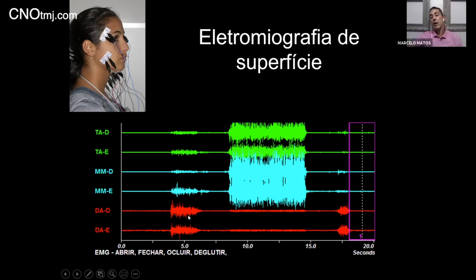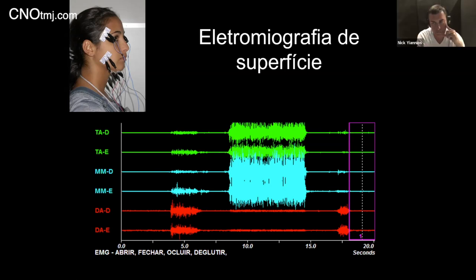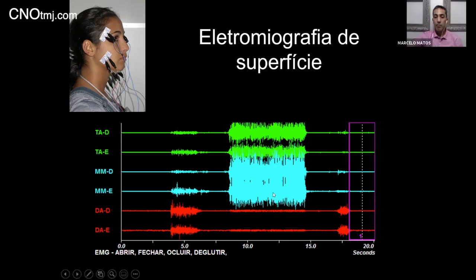But this is not enough. This is not all we can do with the EMG. Let's say this person fires around 80 microvolts. Is it good or bad? Depends. If the person is capable of firing 300 and is only firing 80, it means that most of the muscle is not working during its job. What is the job of a masseter? Close the mouth. So how to understand what is the capacity of that particular muscle or that particular person?